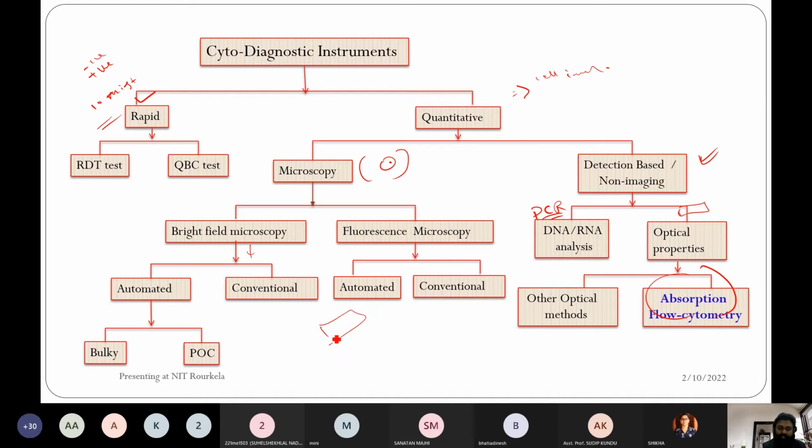Suppose you prepared a device; when you are preparing the device, during that time itself you have to do some sample preparation so that you can directly use the samples to test. And in some techniques, when you are conducting the test, you need to add a fluorescence dye or methylene blue or something else.